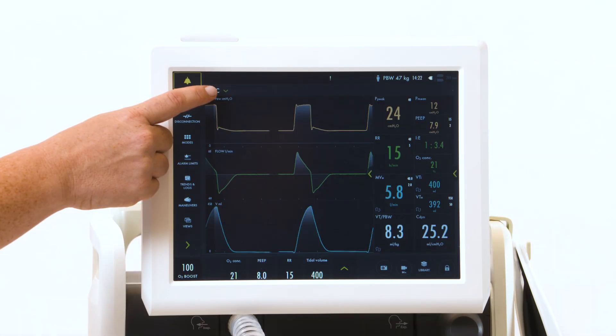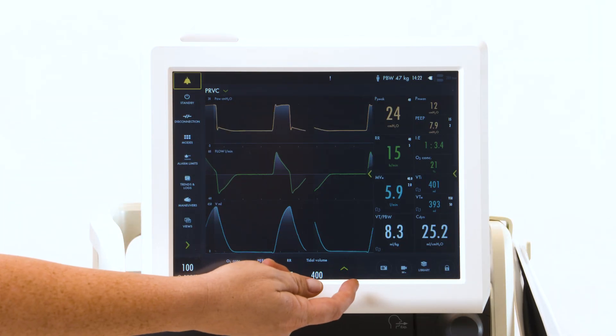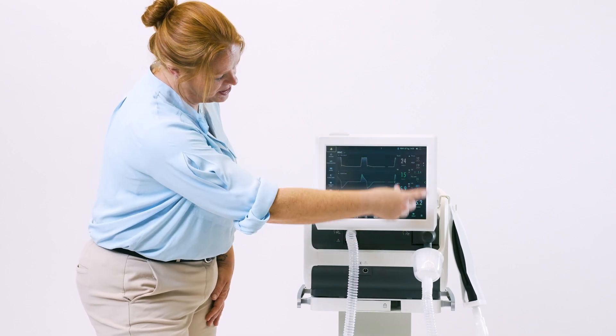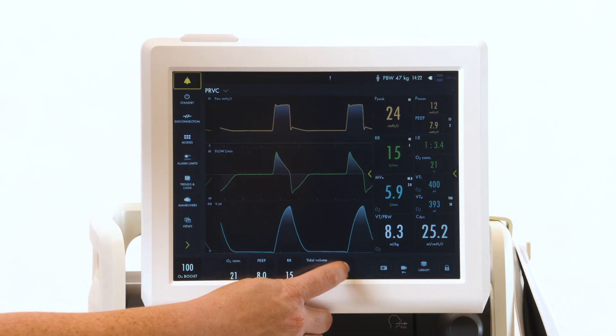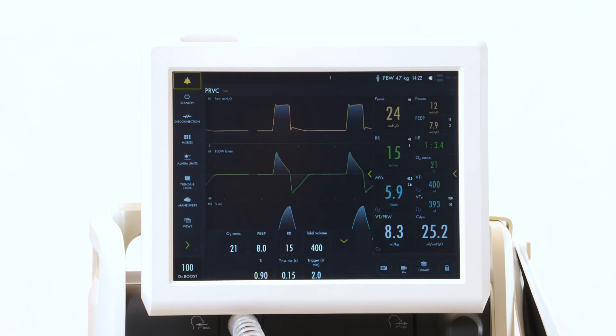Your patient mode is up here with your settings at the bottom. On the right are your measured values. Touch the arrow to open up your advanced settings.